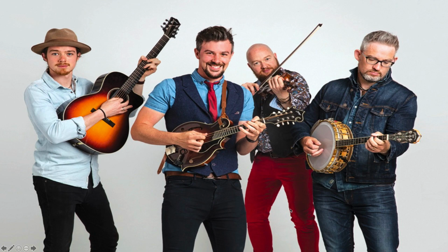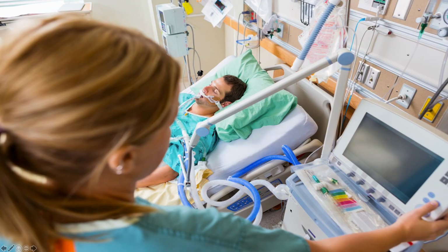Now this is kind of like bluegrass or rock. You have an underlying bass line, an underlying band that's keeping the rhythm, keeping the song going. But if the banjo player feels like stepping up and taking a break and throwing out some licks, then he can. He can go do his own thing, all the while the band and the bass line is running behind him and supporting him. This is going to be your most common mode that you see in the hospital setting.